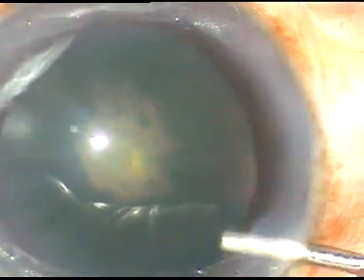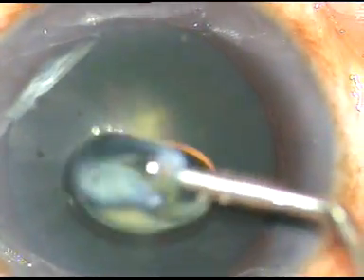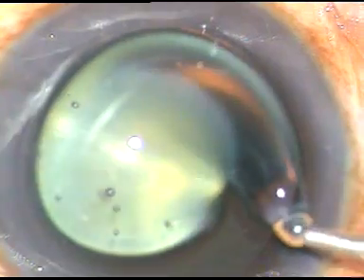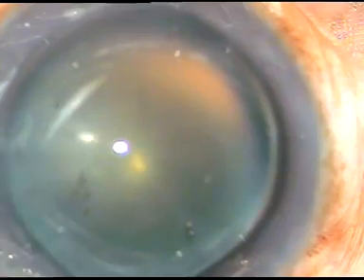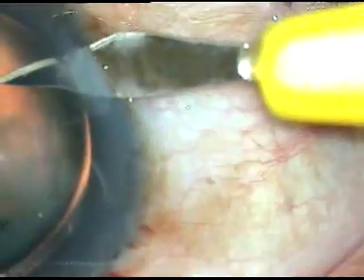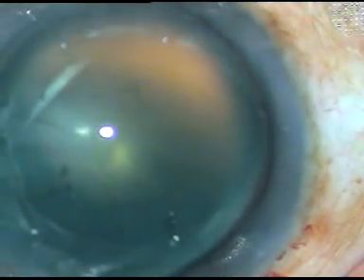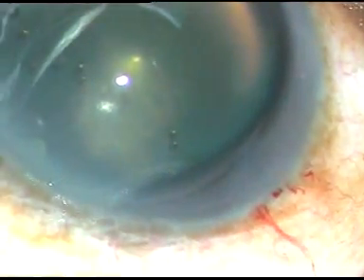A viscoelastic substance is injected into the anterior chamber and it is spread over the epithelium for better visibility. Now two side ports are made — one on the right side and one on the left side.